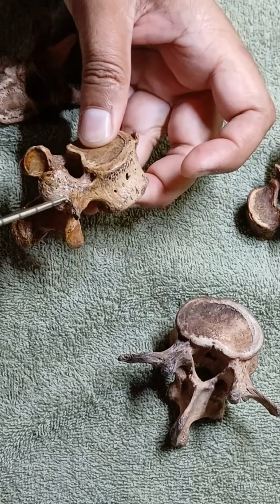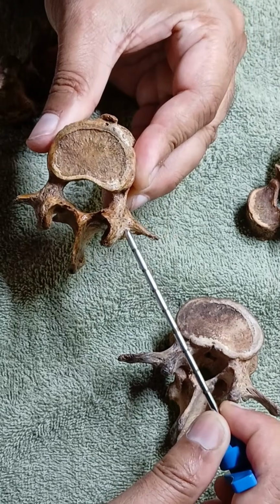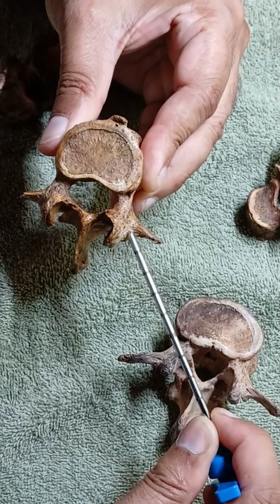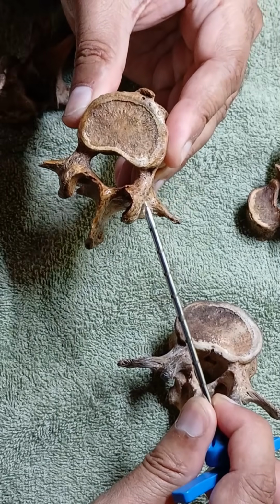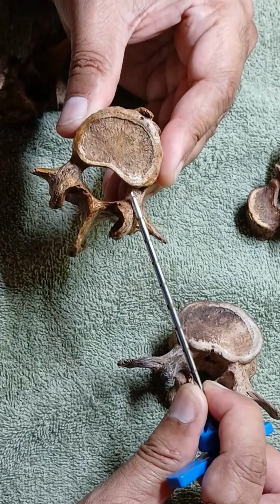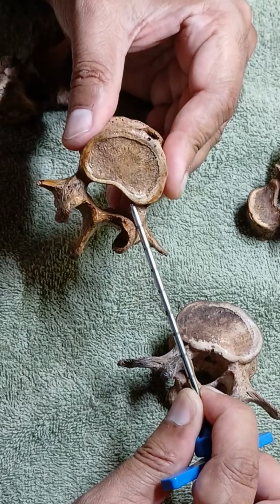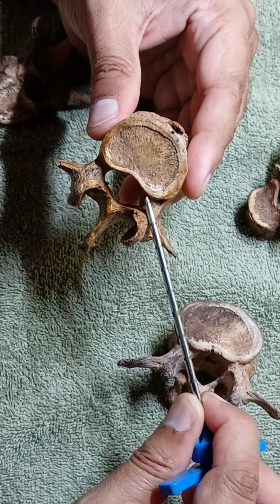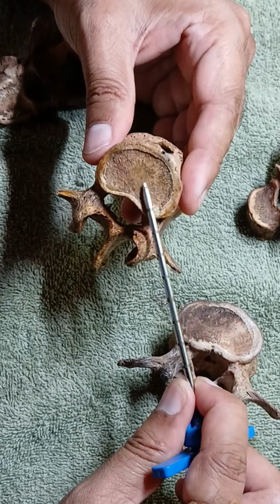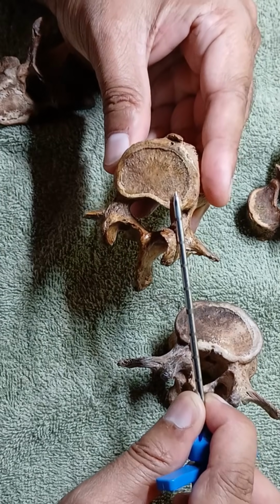Simultaneously you have to take the needle as far medially as possible, so that it comes more medially until in the vertebral body I cross the medial border. In this way you will come more medial to the body, otherwise your needle will go more laterally.